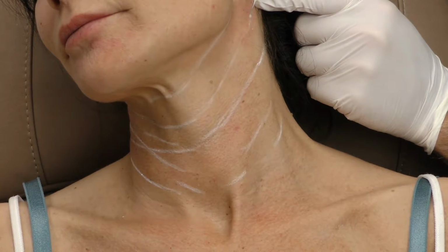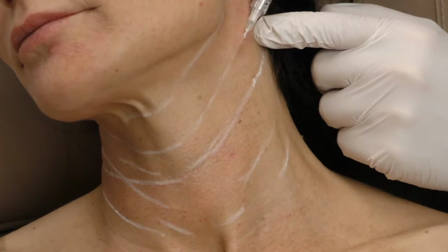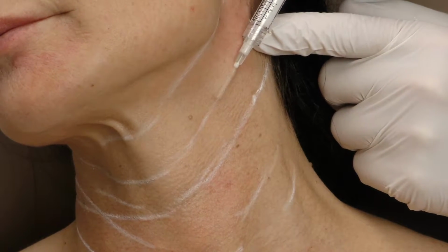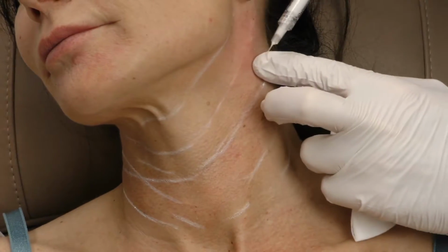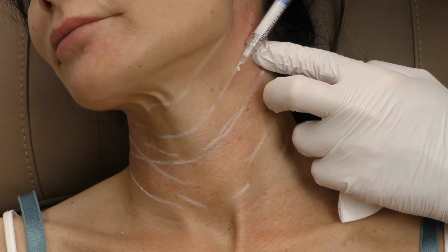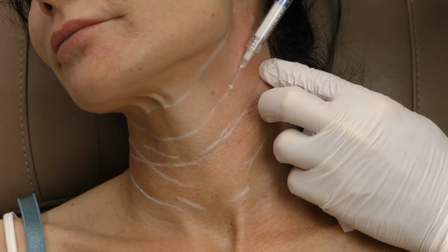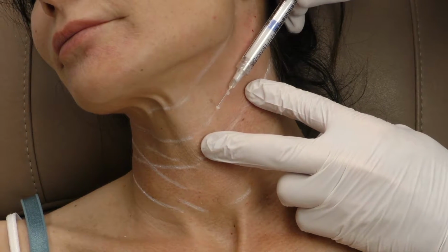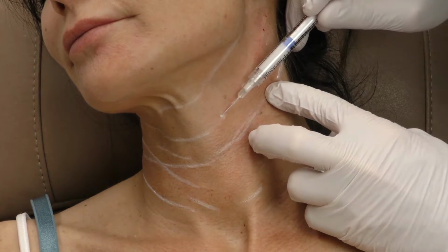This is how I learned it from Dr. Chow from Taiwan. He was the first one to actually publish this, and I'm using his technique. It's working quite well. And especially the long term, if you see the patient after about 3 months, you'll see that there's a significant difference in these horizontal necklines. So every retrograde is about 0.05 milliliters.